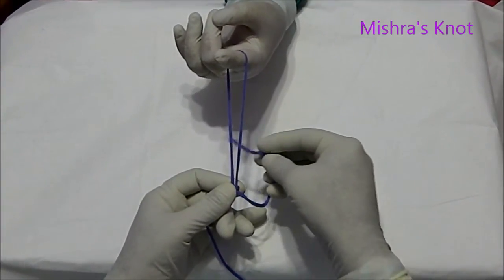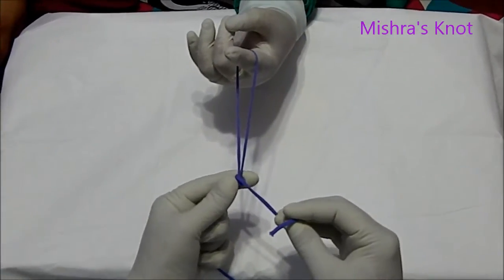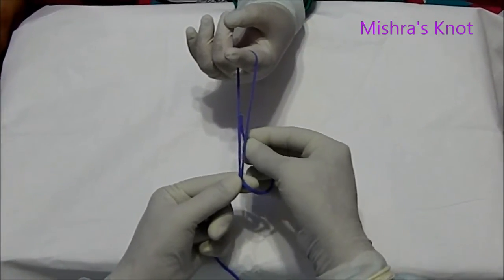Then the second wind will be taken. After the second wind, you have to take the second half knot.